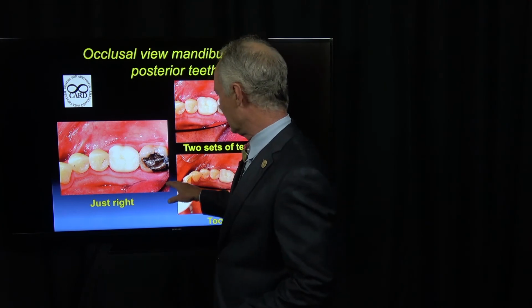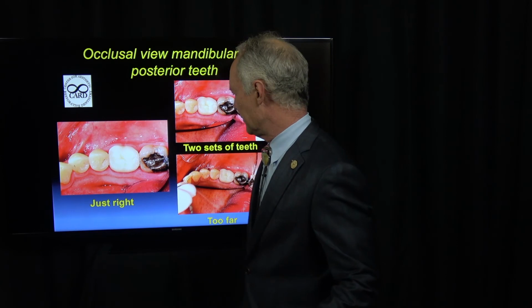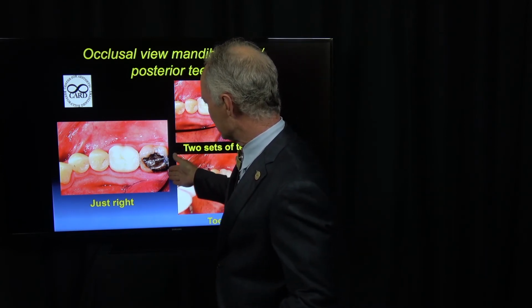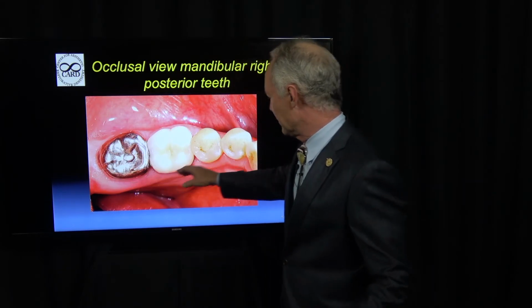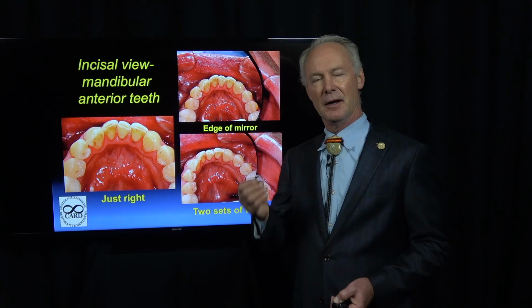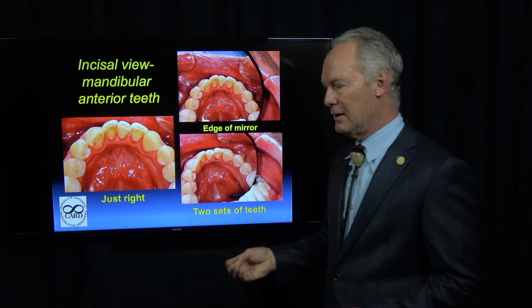This is what you want. Straight line along the long axis of the teeth. And you want the picture to go from about the posterior of the second molar to the cuspids. Right, same thing. See, I'm taking all the peripheral stuff out, so the focus is on the things I want the patient to see. We're not trying to sell anybody anything. The objective of these photographs, again, is for the patient to understand their presenting situation and what pathology looks like.